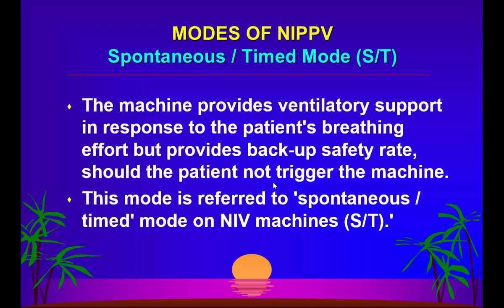The other difference is between non-invasive ventilation and the pressure support ventilation that you have. In pressure support ventilation, if you apply the pressure support, it is above the PEEP. So if your patient has a pressure support of 10 and a PEEP of 5, the total pressure of this patient would be 15. 10 plus 5 is 15.